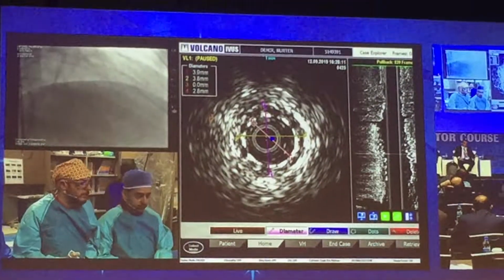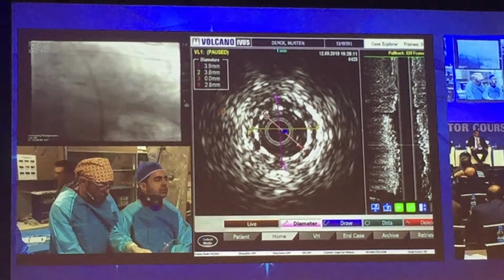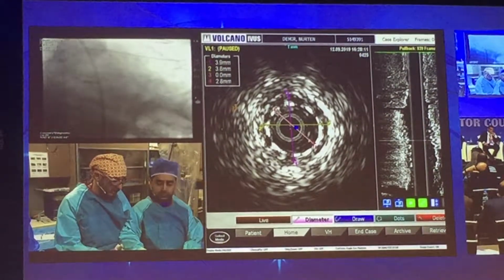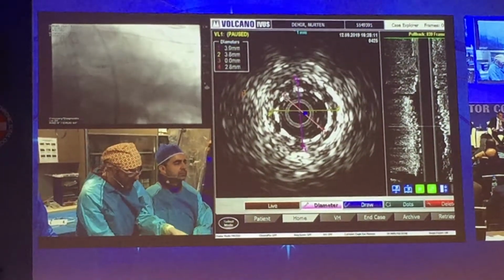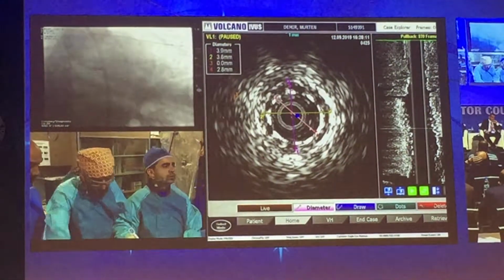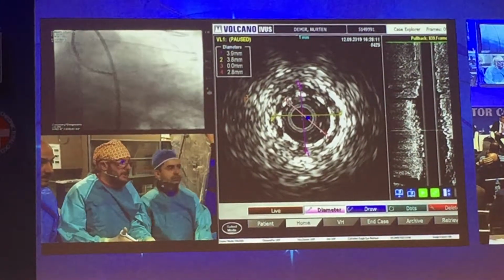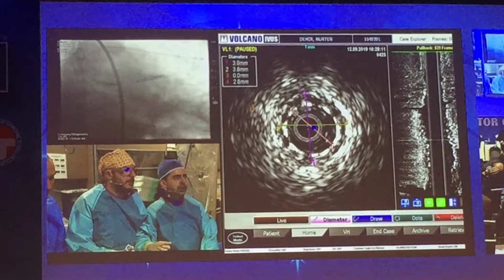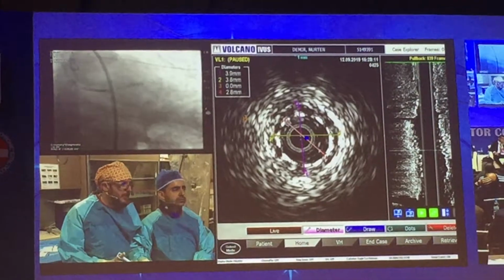Caudal, please, caudal. Yes, the measurement from the IVUS is, the stent diameter is 2.8. Contrast. It's a very undersized stent here. So our first, you are very right. I totally agree with you. Contrast. Okay. And now we are ballooning this stent with the 4.15. Enough. Okay. Non-compliant balloon.